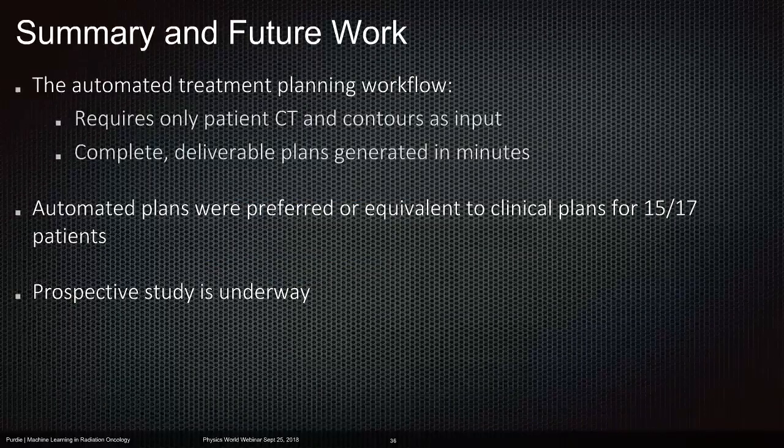So just to wrap up, here's my last slide. We're doing automated treatment planning using machine learning. We only need a CT image and contours. We can generate completely deliverable plans, and we've actually treated 2 patients using this exact method, and we're having a study ongoing.